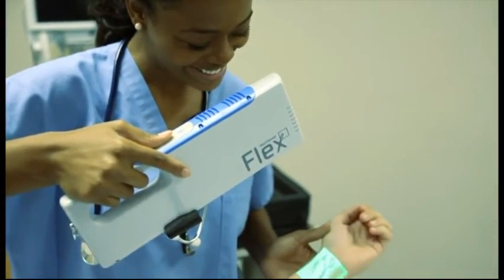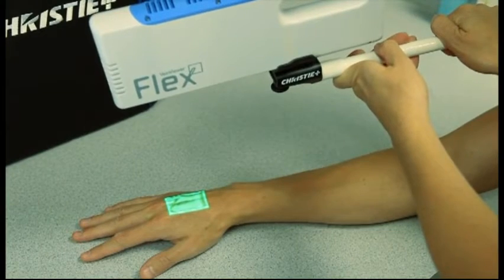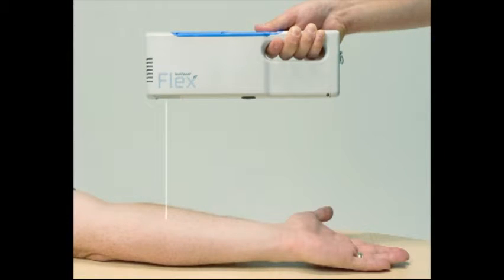VainViewer Flex is simple to focus and use. The proper focal distance for VainViewer Flex is 12 inches or 30 centimeters from the surface of the skin.